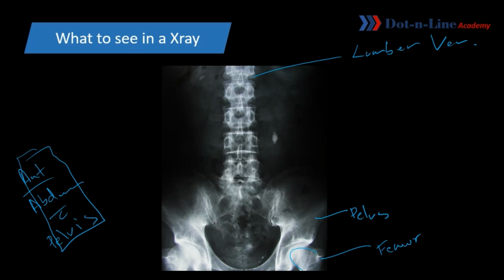So in this X-ray, just pause the video and find the defect, disease that you can detect from this X-ray. Just first go through the anatomical structures and then find the defect. It will be hard for you, but you practice it. So many of you would have not found any fracture. You must be finding any fracture, right? There is no fracture here. If you are thinking that this is a fracture, no.